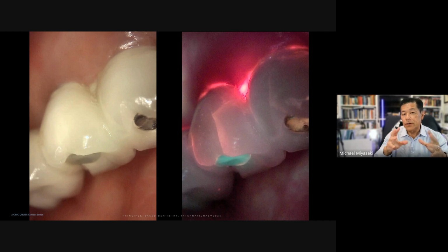We're going to lose bone, and these implants are going to fall out unless we can do something to treat this. One of the big things is you're going to have to be really good with oral hygiene. And I will tell you, in this patient's case, that's going to be very difficult. The patient's manual dexterity is not the best. Vision is not the best. So this can present a problem. But the nice thing is we have this documented.